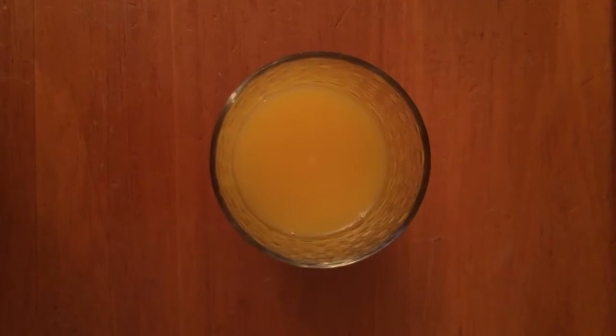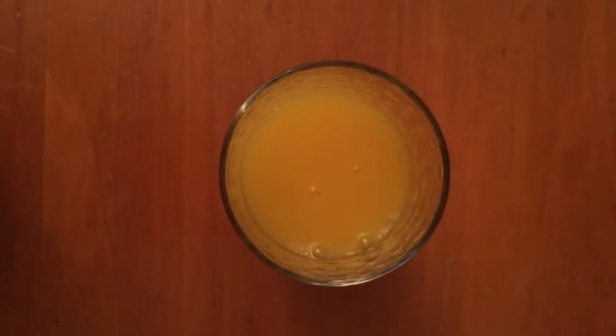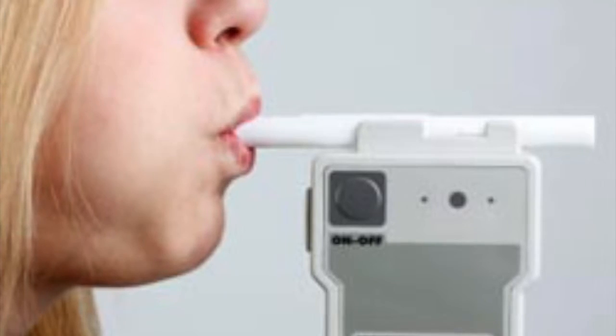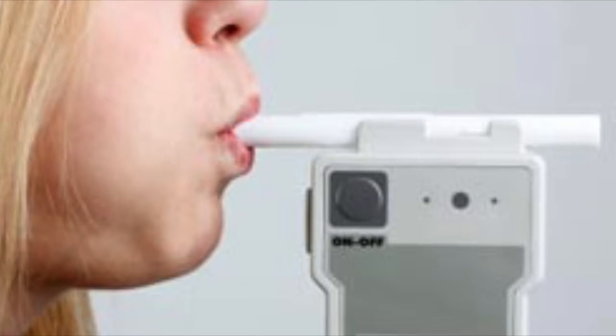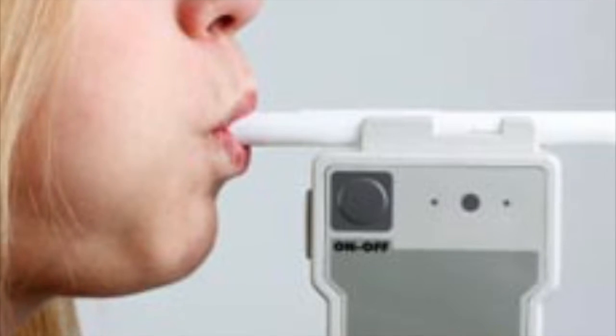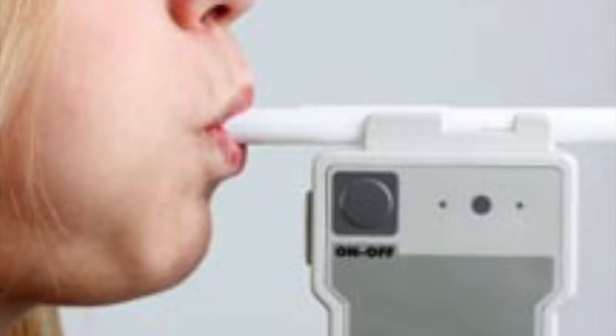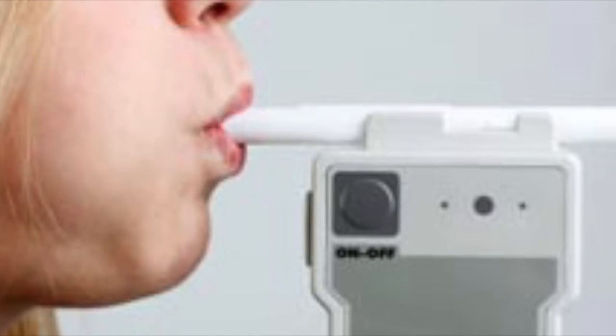In the breathalyzer, a reddish-orange dichromate ion changes color to a green chromium ion if alcohol is added. The color is affected by the amount of alcohol tested in the breathalyzer, so it could be darker or lighter depending on how much alcohol the suspect has in their breath. In a vial of unreacted mixture, you can tell how much alcohol is used by a photocell system that produces the electric current. This causes the needle in the meter to move from resting position to a greater number if there's more alcohol, or to just a little bit depending how much the suspect has.